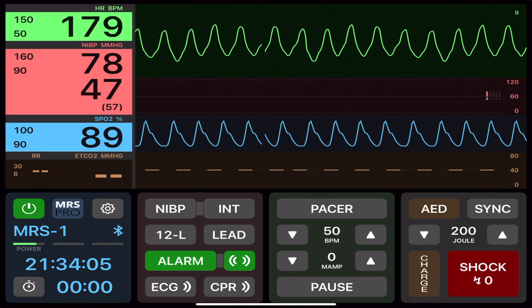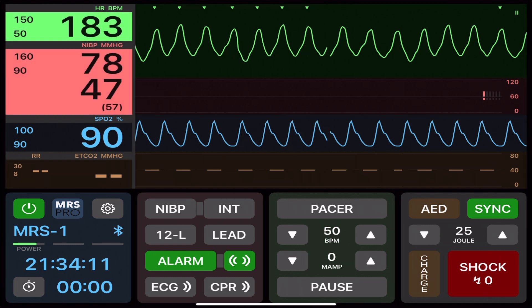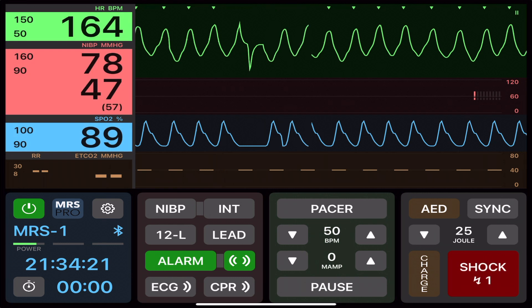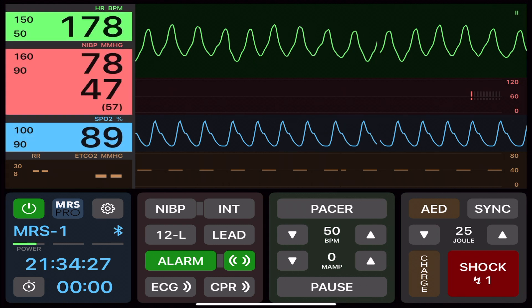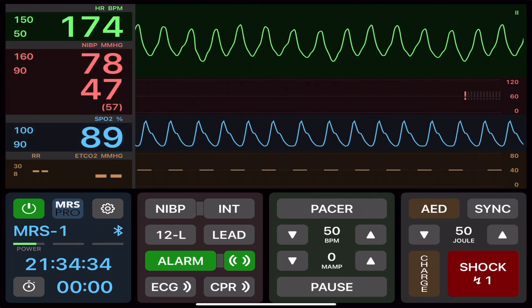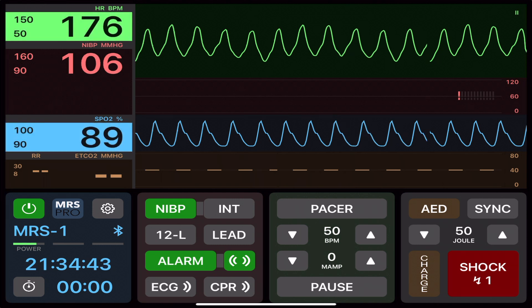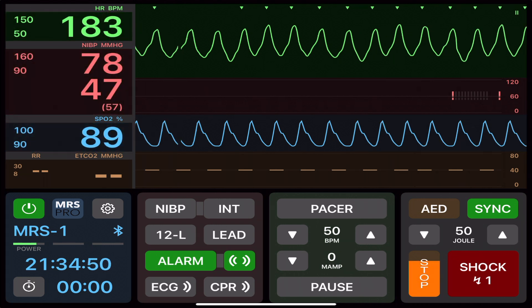Put the device into defib mode and activate sync. Select 25 Joules, press charge, ensure everyone is clear, and then push and hold the shock button until you hear that the shock has been delivered. The device will not deliver the shock unless it's on top of the R-wave. In this example, the rhythm did not convert, so we increase the Joules setting to 50 Joules. Note that some devices, once you've delivered the synchronized shock, will deactivate sync mode, and you will need to reactivate it.